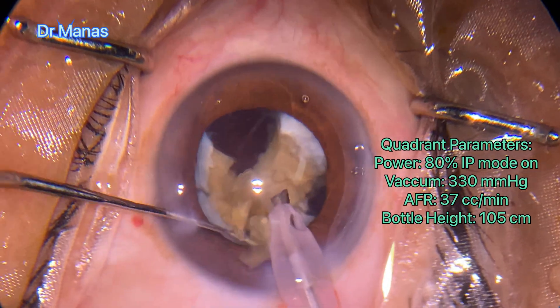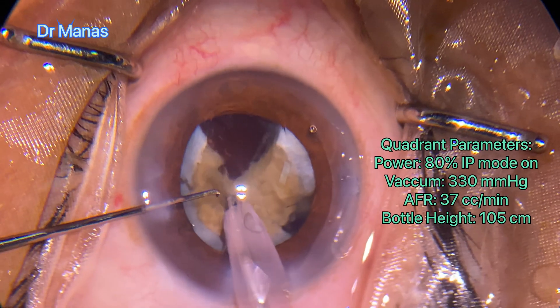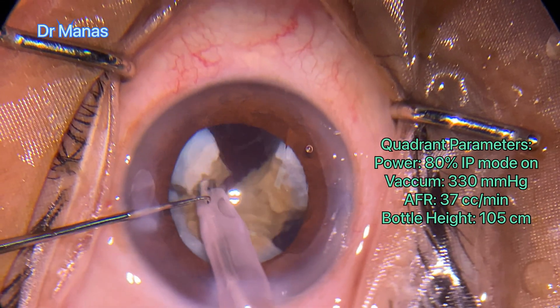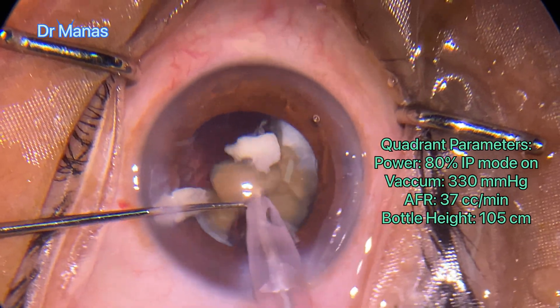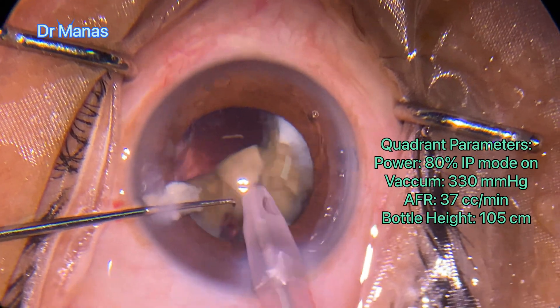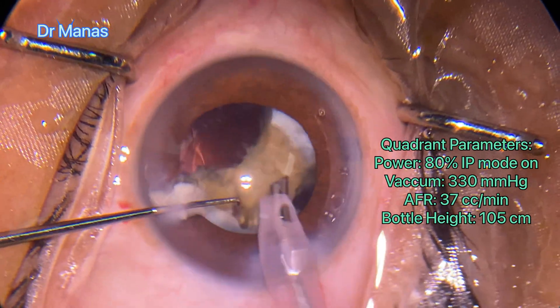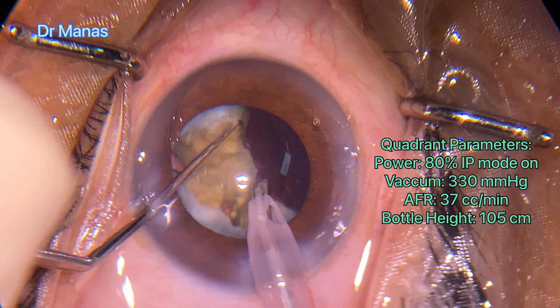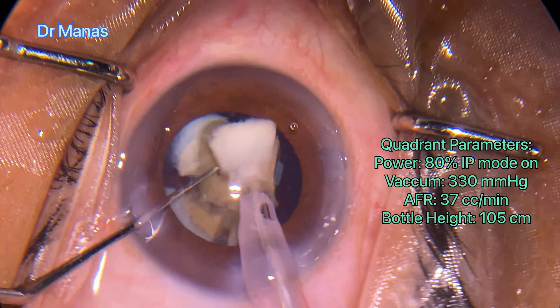Since I'm using very high power, one should be very careful not to end up with a wound burn. Here I have used IP mode — one can tell the assistant to keep hydrating the tunnel area. It's a bigger chunk, so I'm doing a sub-chop.